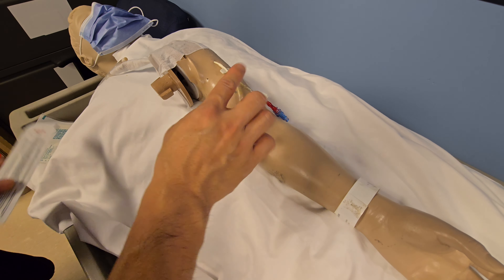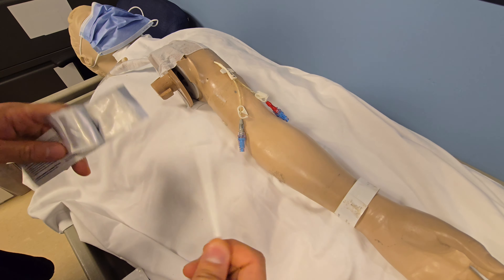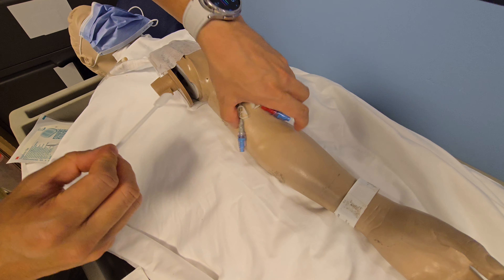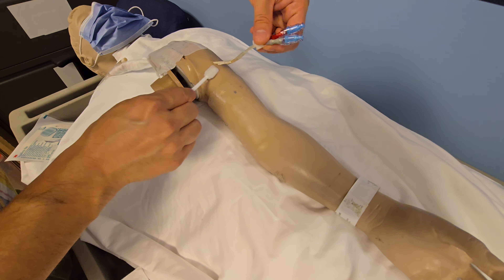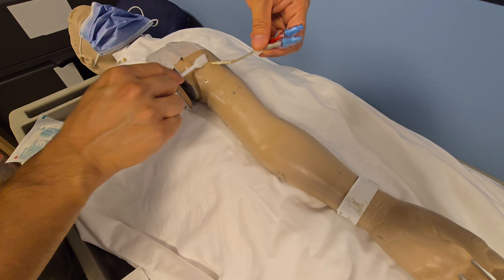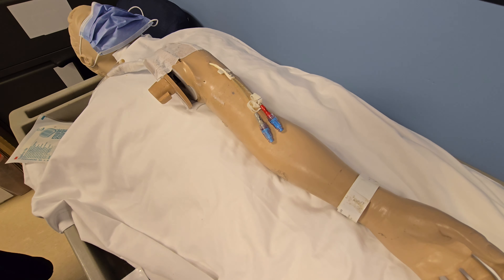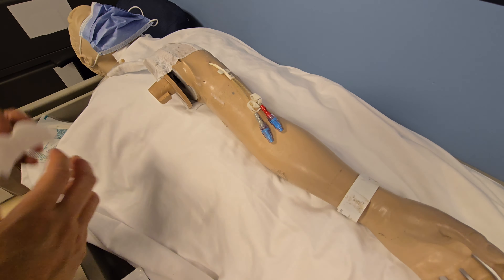Once you have done that and removed the previous dressing, just a few cardinal rules. Number one, clean it with chlorhexidine, starting from the center — always from center to peripheral, or from clean to dirty. Once we have cleaned that up, you're going to let the site dry for a bit.